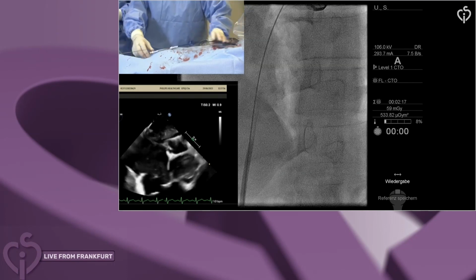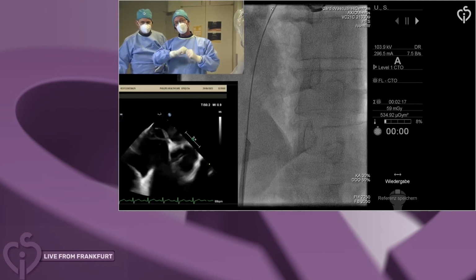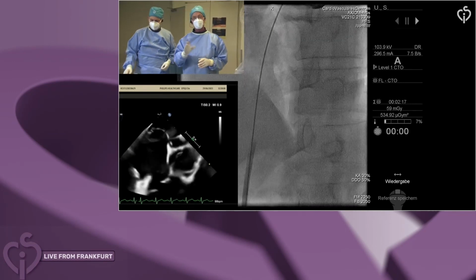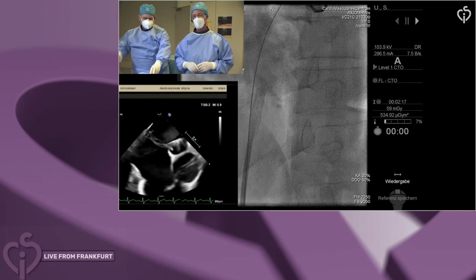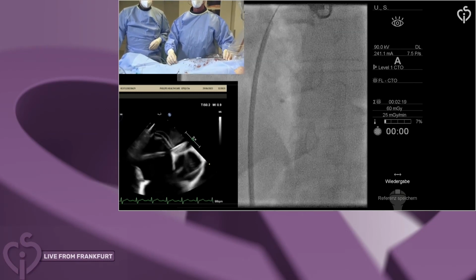No, it doesn't work here. So then you see the length of the tunnel very nicely, and you also can see the diameter because the jet of the injection opens up the PFO, and we compare this balloon with balloon sizing, it's almost the same. There may be a millimeter difference or so. But in this case, it does not work because the PFO tunnel is just too short. It's almost like an ASD. So we will proceed under echo guidance more than under angiographic guidance here.